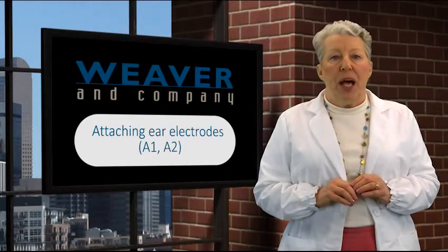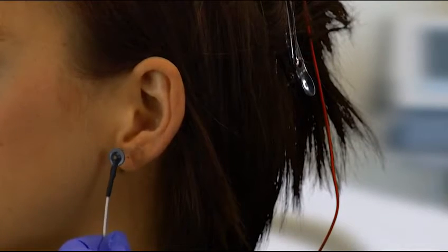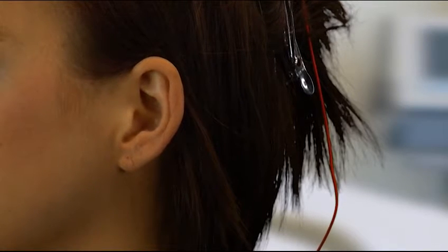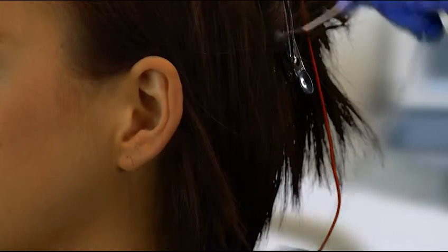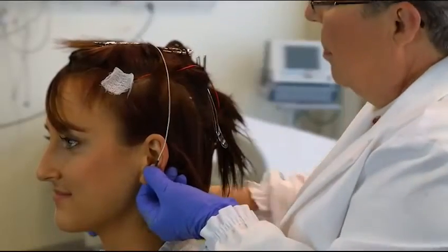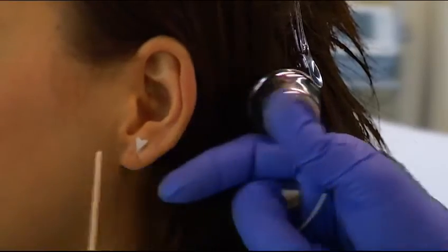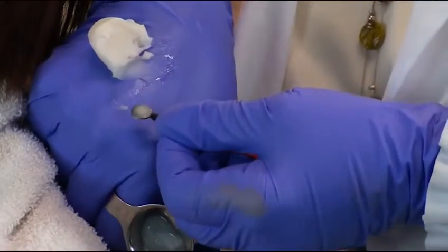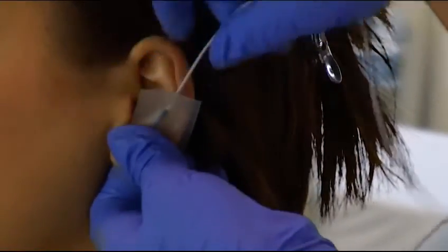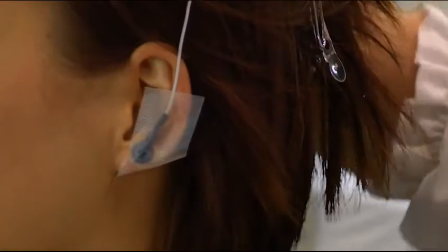Now let me show you a way to apply electrodes A1 and A2. If you place the electrode so that the tail is pointing down, the wire electrode is heavy and it will pull it off. If you put the electrode on so that the wire goes up and over the top of the patient's head, that will help hold it on. Prep the skin on the ear with Nu Prep. Fill the electrode cup with the 1020 paste so it's level. Using the tape, place the electrode just so. Wrap the tape around the ear to help hold it on and keep it firmly in place.